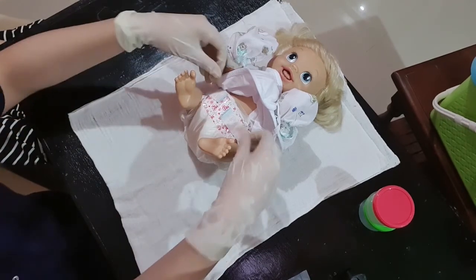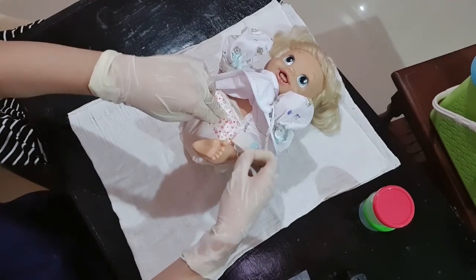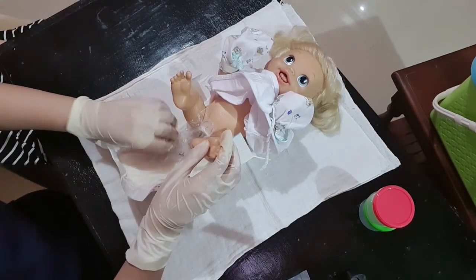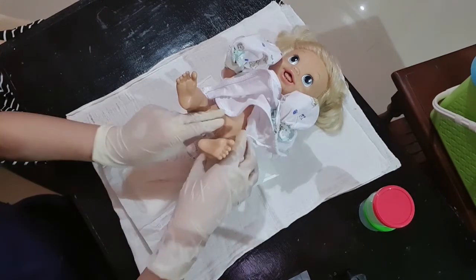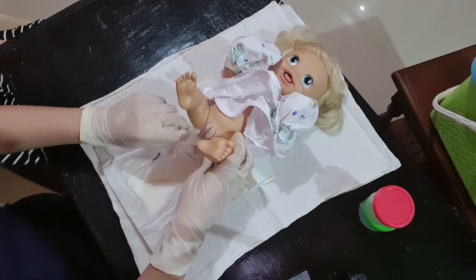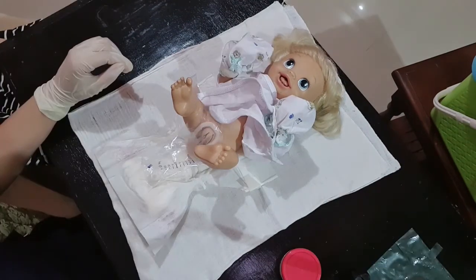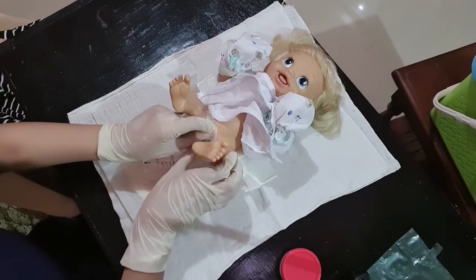Then, I will check the bag at least every 15 minutes until an adequate amount of urine is collected. Do not leave the bag on for more than 1 hour. Take the bag off if the skin develops irritation and or symptoms of allergy. This is to check if adequate urine is already collected and to avoid leakage. When an adequate amount of urine appears in the bag, I will now remove the bag gently.